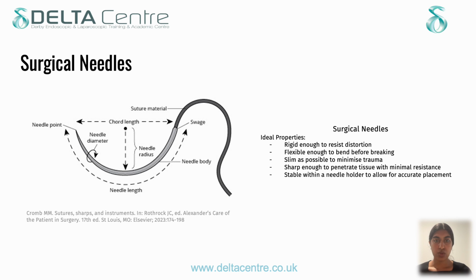And there are ideal properties of surgical needles. They need to be rigid enough to resist distortion, but flexible enough to bend before breaking. They need to be as slim as possible to minimize trauma, and sharp enough to penetrate the tissue with minimal resistance. And they also need to be stable within a needle holder to allow for accurate placement.